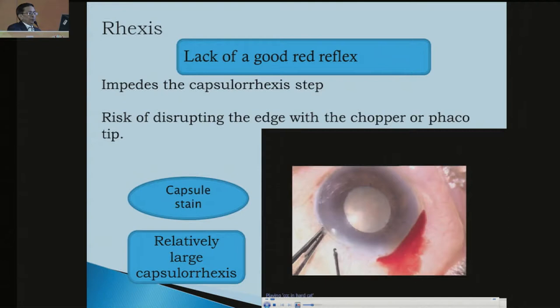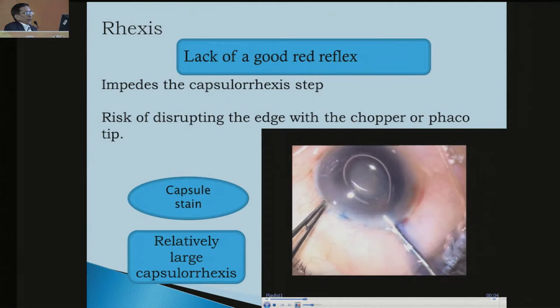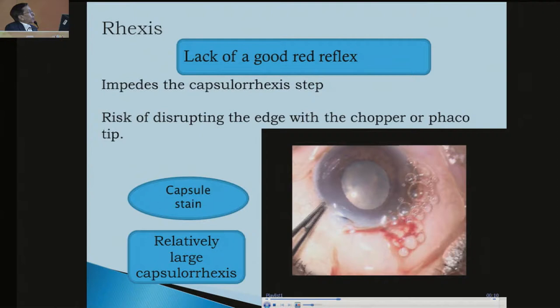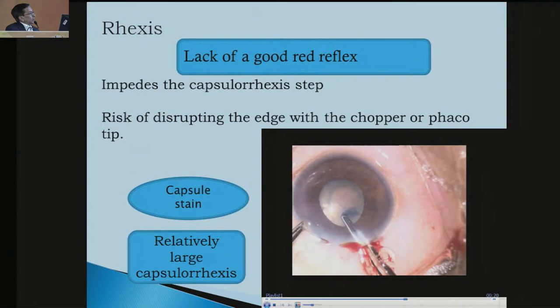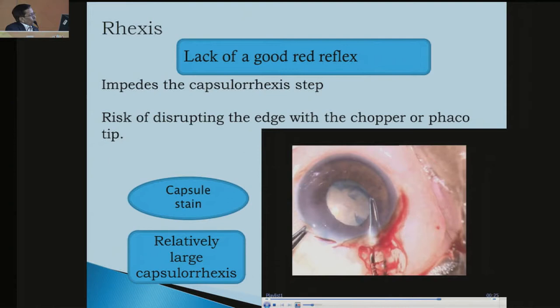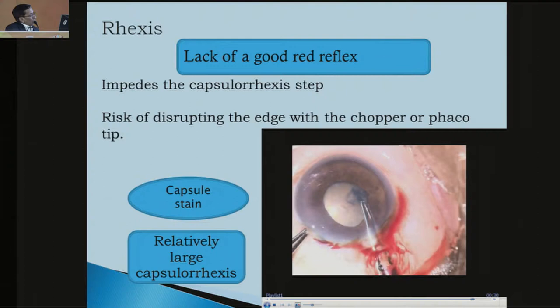This is how a small pupil, mid-dilated pupil, presents. A lack of good red reflex impairs the capsulorexis step, with risk of disrupting the edge with the chopper or phaco tip - capsule stain may be needed. You should try to give a larger rhexis. Because of the poor pupillary dilatation, try to cover it up to the pupillary margin so you can get a good, large capsulorexis.